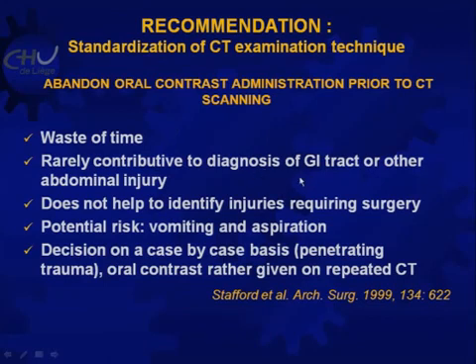It does not help to identify the injuries that require surgery, and there is a potential risk of vomiting and aspiration. In some patients, very few, particularly with penetrating trauma, we can give oral contrast, but usually not at admission, rather on the delayed, repeated CT examination. So forget about oral contrast, it will not be given anymore.